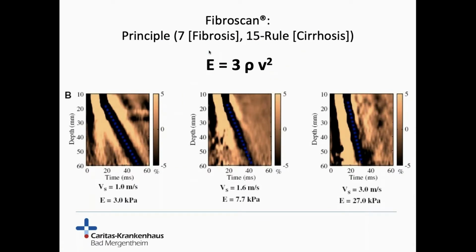Physically, the shear wave is measured as a velocity which can be calculated and transferred into kilopascal by the formula shown.